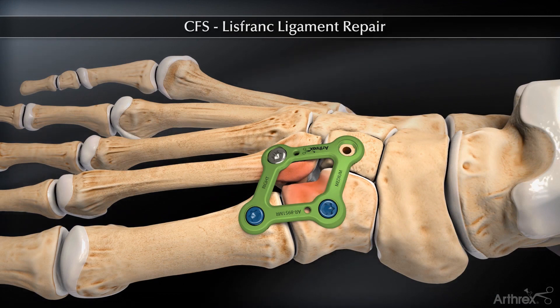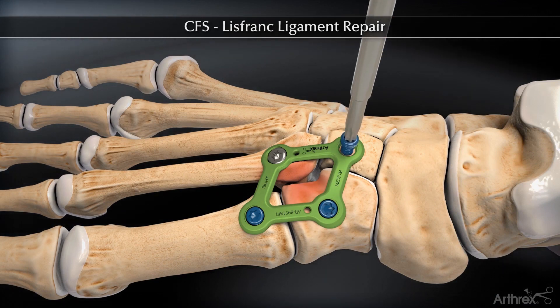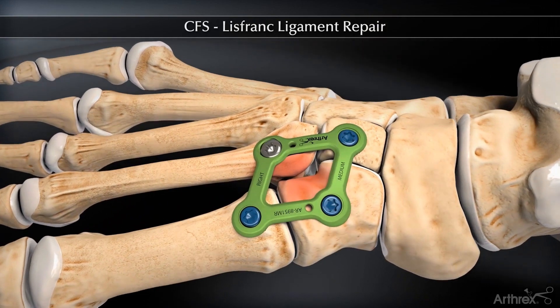The Arthrex Lisfranc plate provides the surgeon with a low profile option for optimal compression across the Lisfranc joint while not violating the Lisfranc joint.